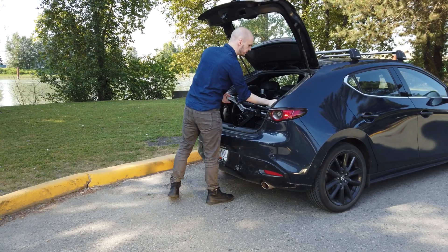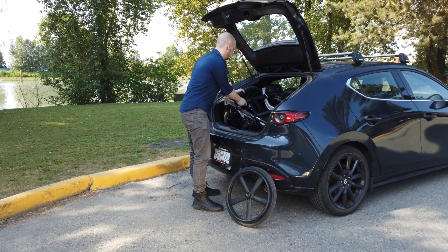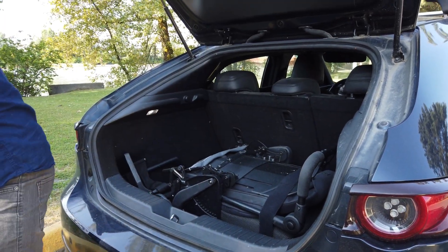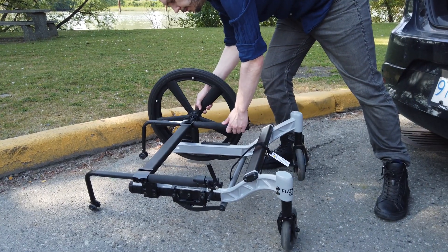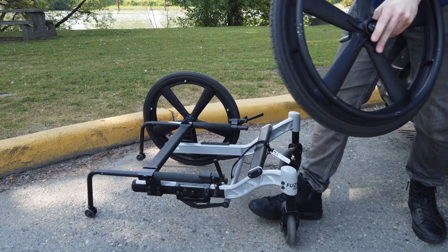When reassembling the wheelchair, begin by unpacking the accessories on top of the lower frame. Place the lower frame on the ground and attach the rear wheels. Be sure to lock each wheel in place using the wheel locks.